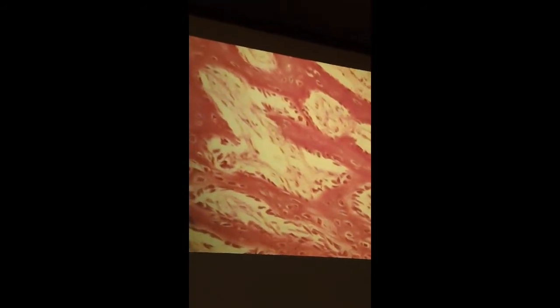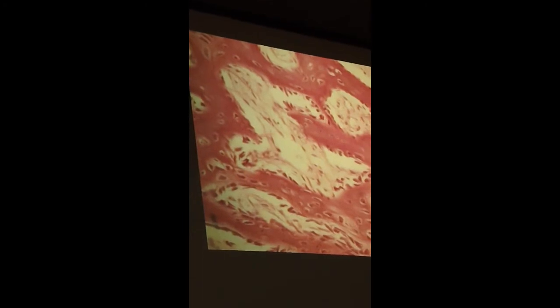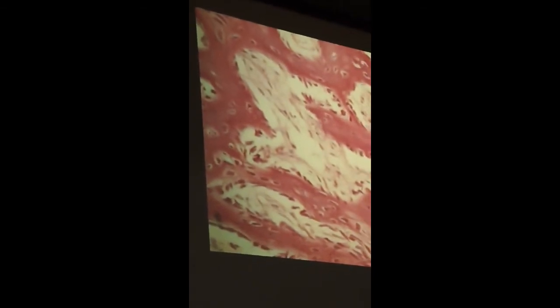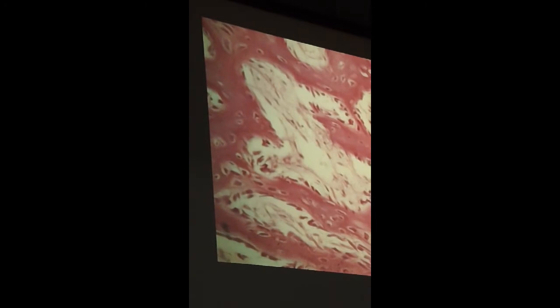Okay, this would be called spongy bone. You can see the trabeculae that are interconnected here, marrow space. So if we're talking about bone, we're talking about 4 or 5 cells, right? Cells that are on bony surfaces could be an osteoprogenitor cell, could be an osteoblast. If it's an osteoblast, it's generally a plump cell, right?